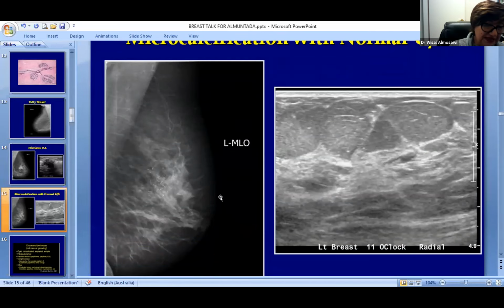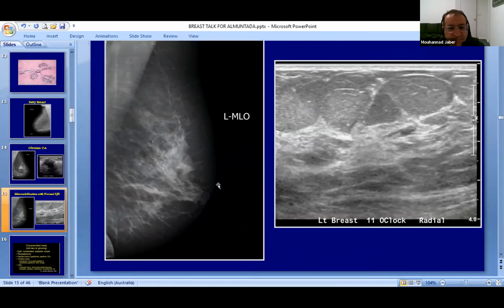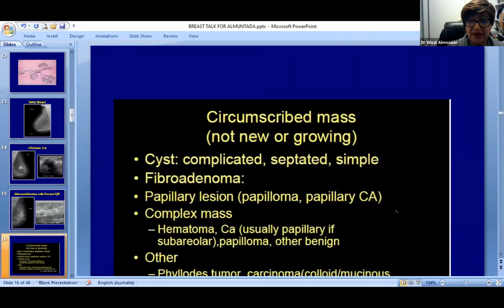Microcalcification, I don't know if you can see, can you see the images clearly? Very clear, yes, we can see very clearly. Okay, so this is the sort of calcification we worry about. I mean, there's benign calcification, and we don't worry about it. The one we worry about the most is when they cluster together, when they're branching, which we know is inside the duct, when they don't have a uniform shape, when they're different sizes and different shapes. That's what we worry about.